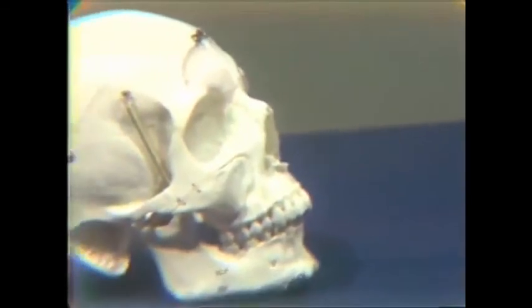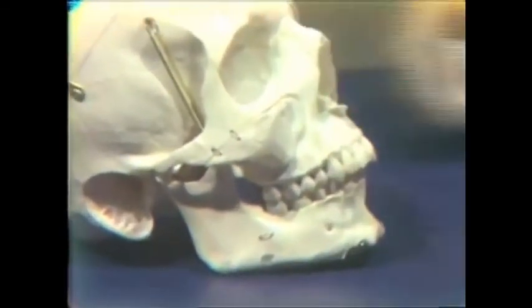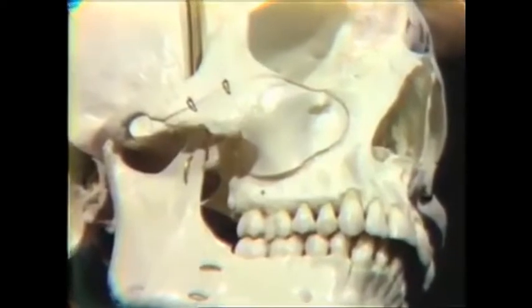All right, let us show you on the skull now how we accomplish this. I'm going to tip the skull over here just a little bit so you can see a little better. All right, with the mouth half closed and again cheek retracted to get the tissues tense in the vestibular area.